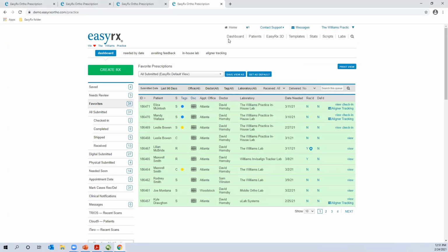I know this is a fairly quick webinar. A lot of times we cover all the aspects of EasyRx. And if you have questions on other things that we have in the software, I'm happy to address those. I just wanted to keep this concise and focused on the aligner tracking side of it. But if anybody has questions about other things, please feel free to ask about those.